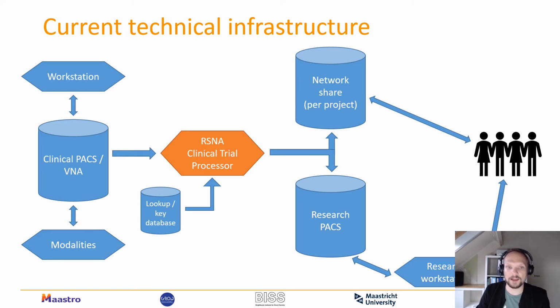Furthermore, what's happening in this CTP is that we de-identify images on a per project basis, meaning that the de-identification process with the rules mentioned before is customized for every research project. I will come back later in this presentation to why as well.